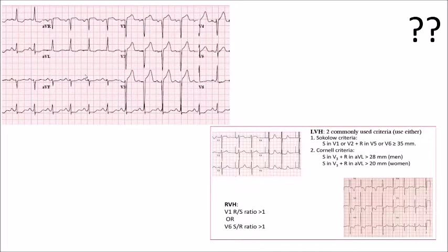I think our colleagues, you understood. Very right. Left ventricular hypertrophy is very easy, doctor. Especially, it's very nice to understand right ventricular hypertrophy, just reverse the ratio. In V1, R will be bigger than S. In V6, S will be bigger than R. That is the reciprocity, if you understand the word.